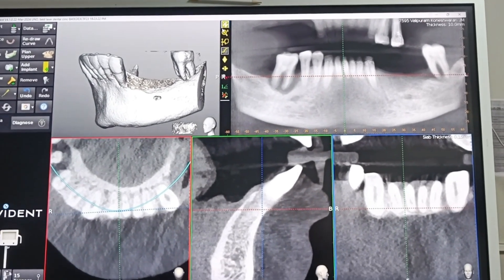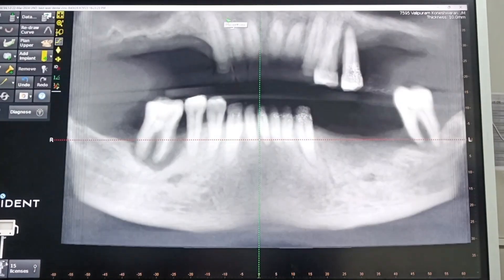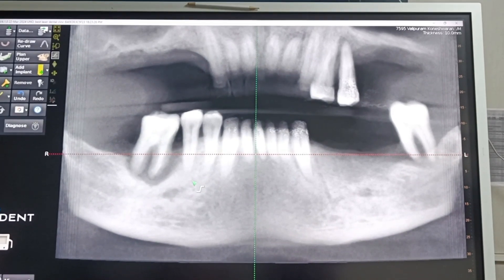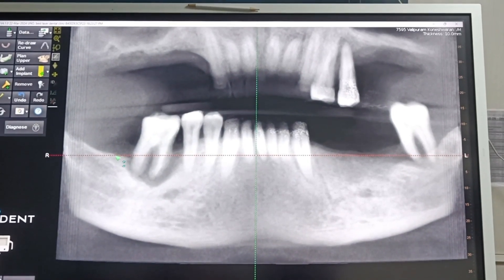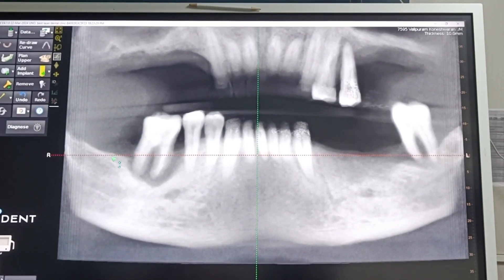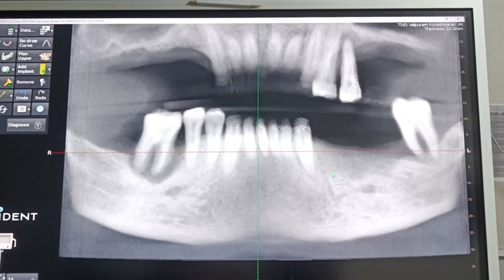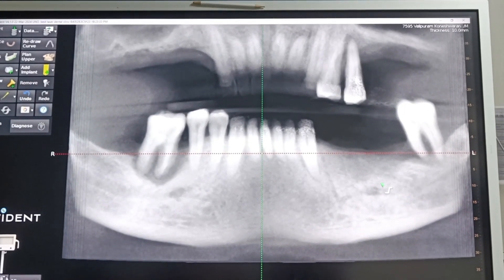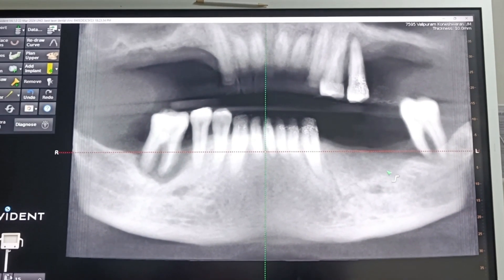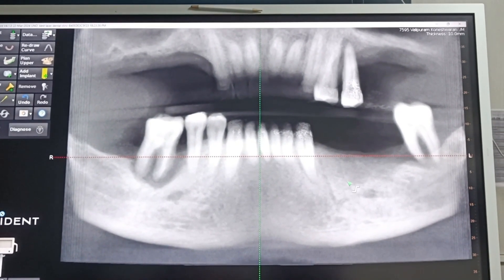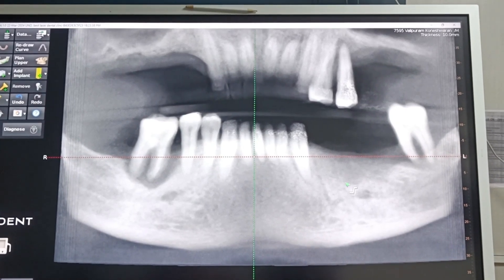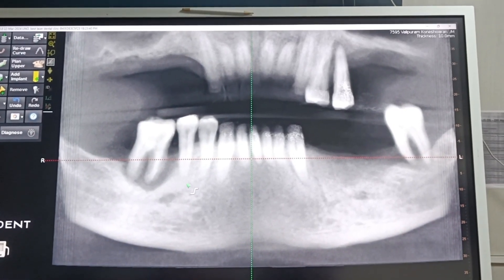We plan for the mandible first. Comparatively, the right side distal mandible is more resorbed than the left side. You can see from this view — this is the canal. The canal height is more on the left side, so the left side will be less challenging than the right side, making the right side more challenging.